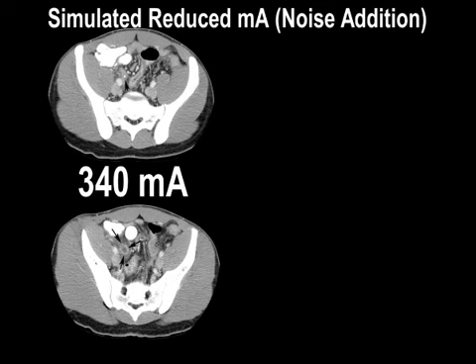So here's an example of what a decrease in tube current will do. This is a teenager with appendicitis. The arrows show where the appendix is down here. All of our scans do come with arrows after we scan them. It's quite nice. I wish.